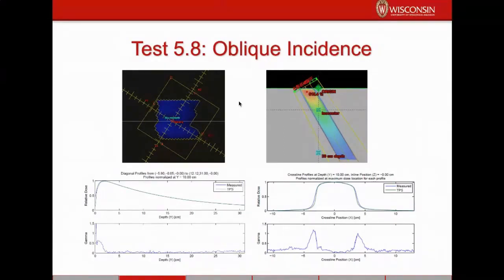We did both and measured both, and it turns out that the treatment planning system does really well with either situation. But trying out these measurement techniques for the first time really was a great learning experience and a way to learn more about how our treatment planning system worked in different scenarios.